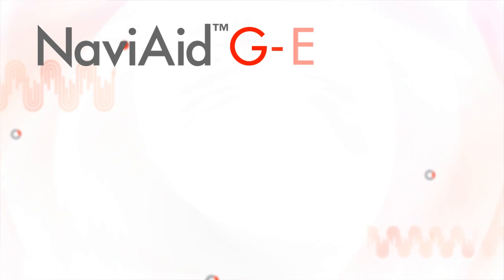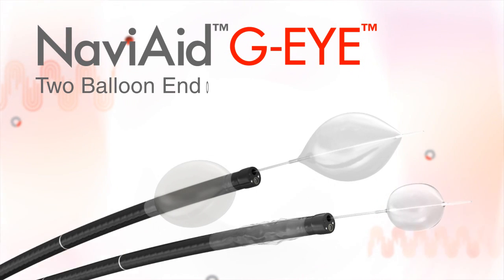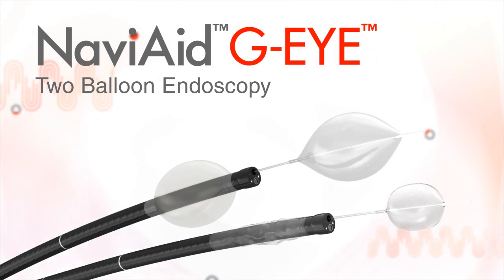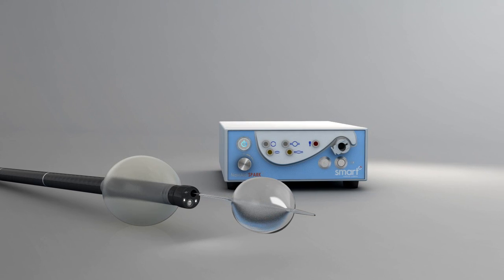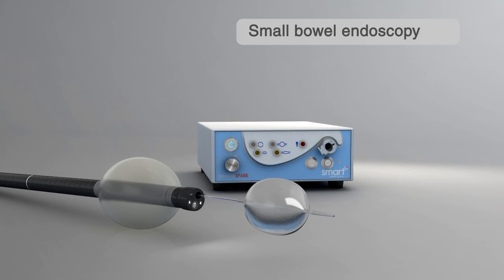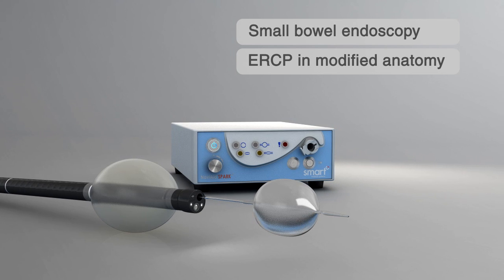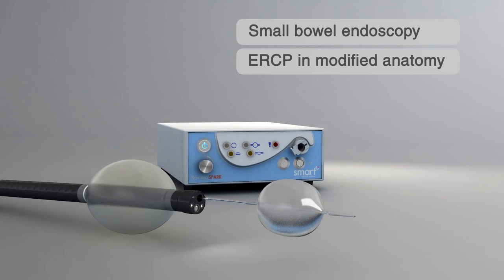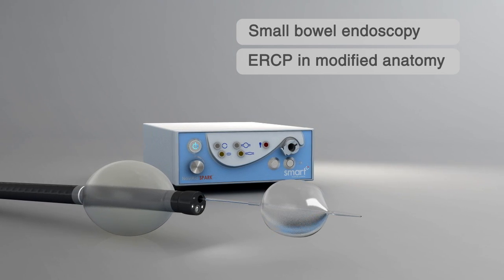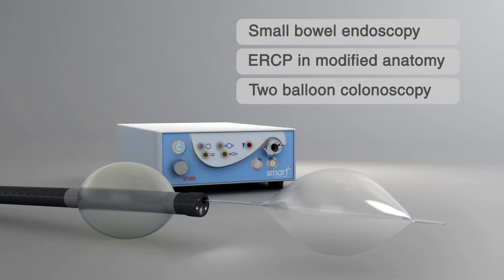The GI endoscope, supported by the SPARK2, can readily function as a two-balloon endoscopy system when combined with one of the NaviAid single-use balloon devices. When operated with the NaviAid A-B device, the GI can perform two-balloon small bowel enteroscopy or ileoscopy, as well as ERCP in modified anatomy patients. When operated with the NaviAid A-B-C device, it can perform two-balloon colonoscopy.